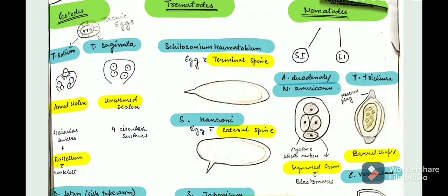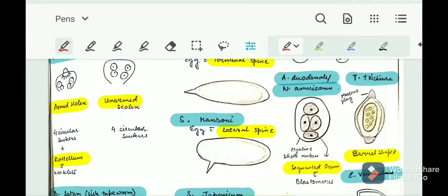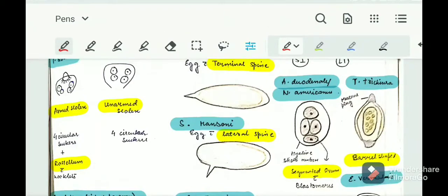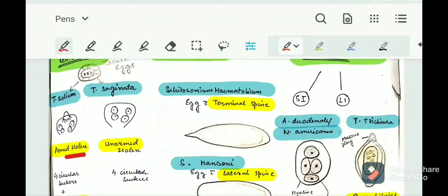Let's start with Taenia solium and Taenia saginata — they both look similar, but how do we differentiate between them? Taenia solium will have an armed scolex, while Taenia saginata has an unarmed scolex. The mnemonic: saginata is a long word — it is big — so saginata doesn't need any arm to protect itself. But solium is small, so it needs arms to protect itself.